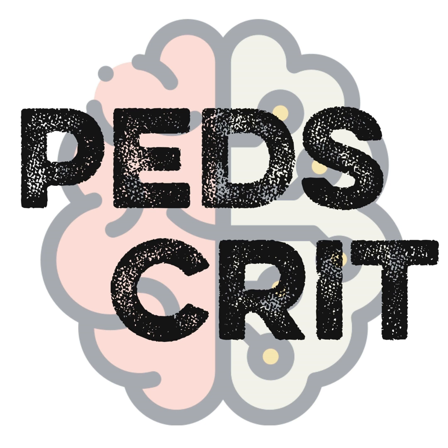And you really need to pay close attention to those, like I've been talking about, to avoid lung collapse and derecruitment during that release phase. To augment CO2 removal, you can shorten that T high and create more releases, at the expense of your mean airway pressure. Your T high is typically set to allow maybe 8 or so of these releases per minute, so perhaps around 4 to 5 seconds, give or take.